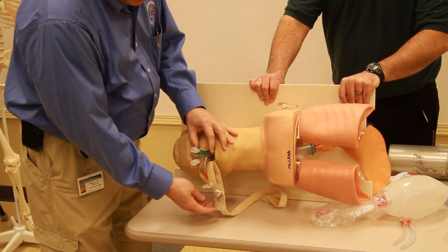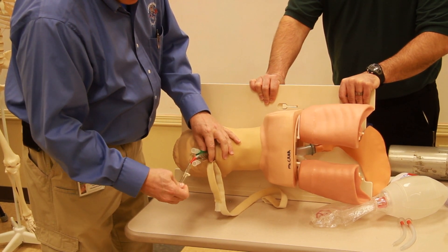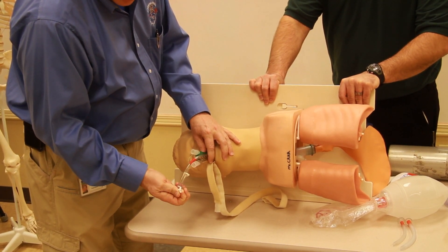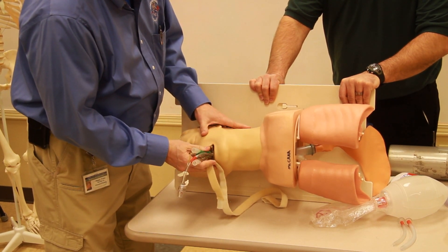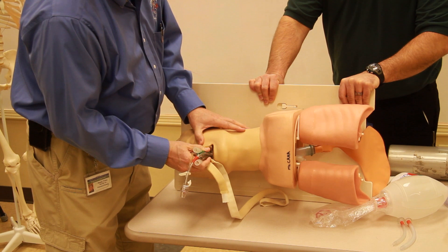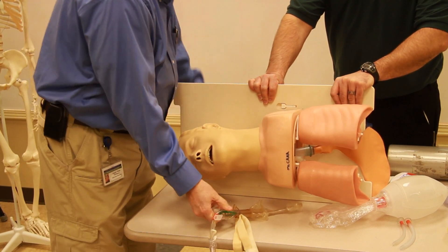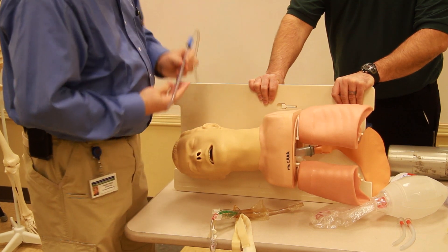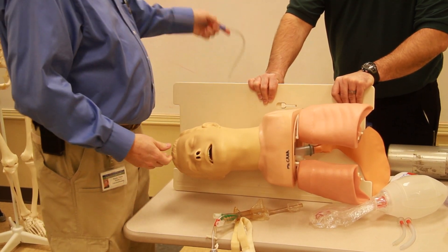I tell the patient: 'You have an airway in your mouth. When I take it out, I want you to forcefully cough when I count to three. Are you ready? One.' I then remove the stopcock to deflate both balloons.